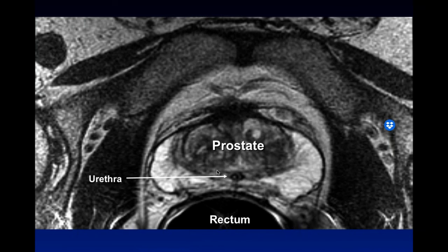But as he starts to biopsy it, that needle can transfer up into the urethra, resulting in a fistula that is non-healing, and then the patient will end up with a colostomy. And we think, well, maybe this probably doesn't happen, but it does happen. In fact, recently I've been asked to review a case specifically where this has happened in the outside community. And I only tell this because it is important to have high quality planning, treatment delivery, and assessment at every step of the process.